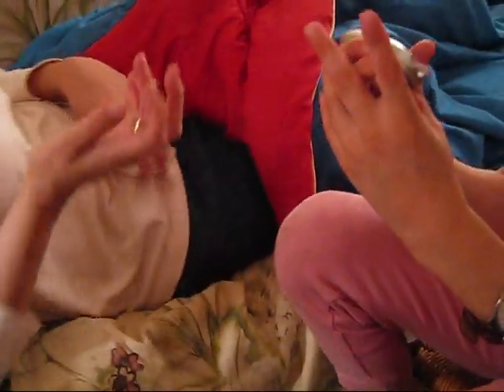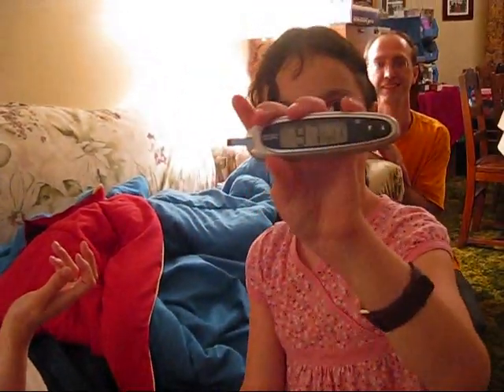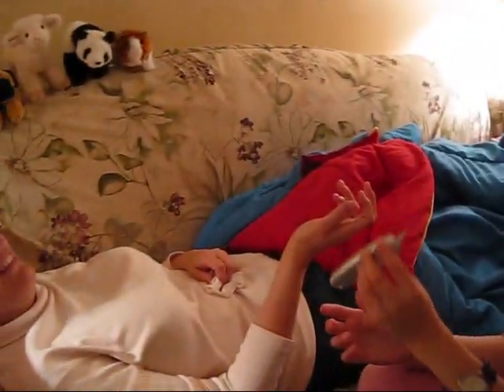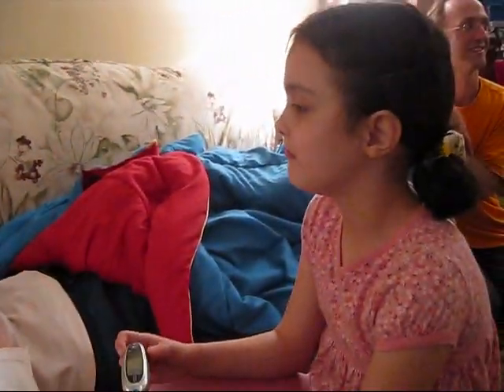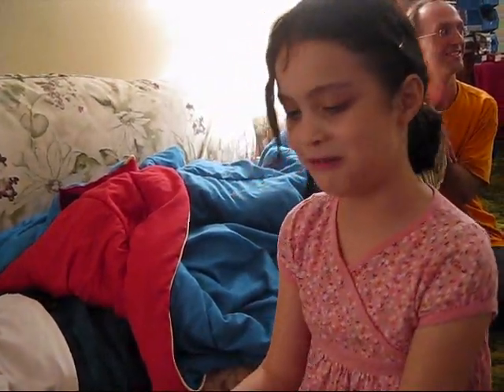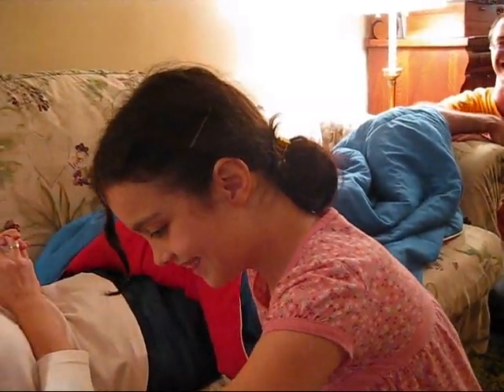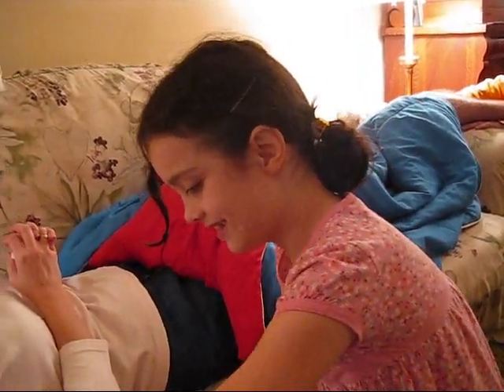It's working this time. It says 97. Is that good or bad, Dr. Yoli? It's good. Oh, is that good? Yes. There's grandma's. Grandma's was in the 100s — 100... 170?